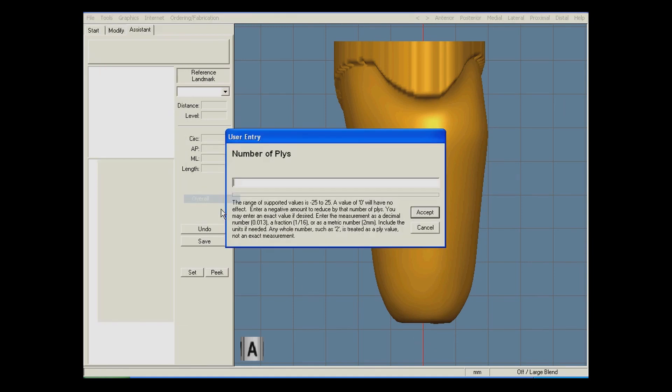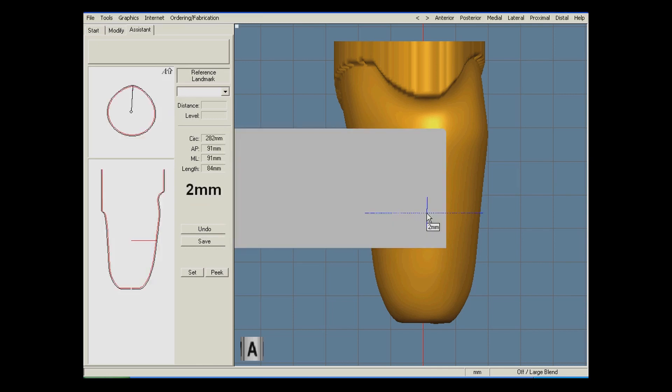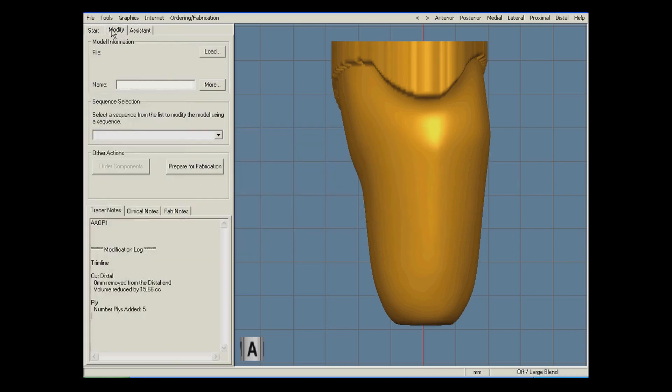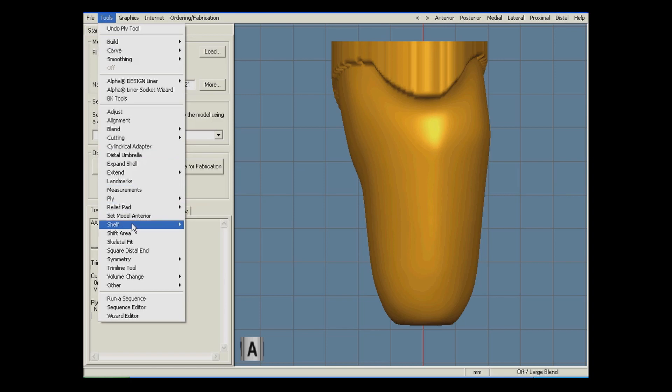Next, I will use the ply tool to increase the circumference of the model by 5 ply. This ensures the patient can get into the socket for the initial fitting.